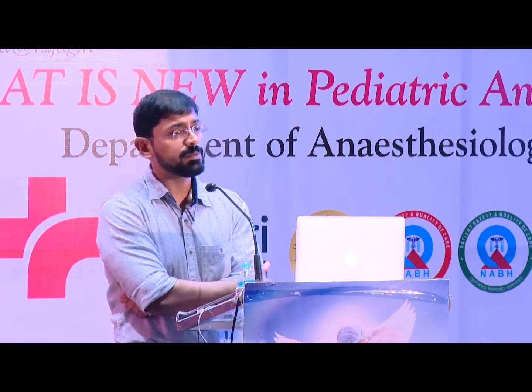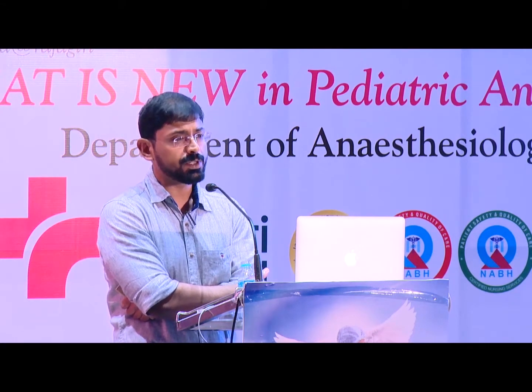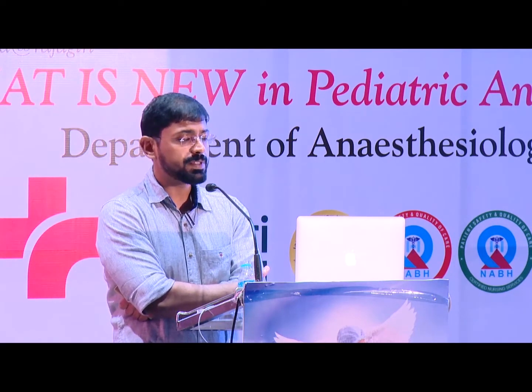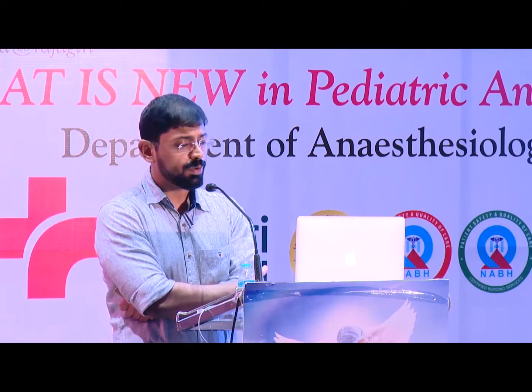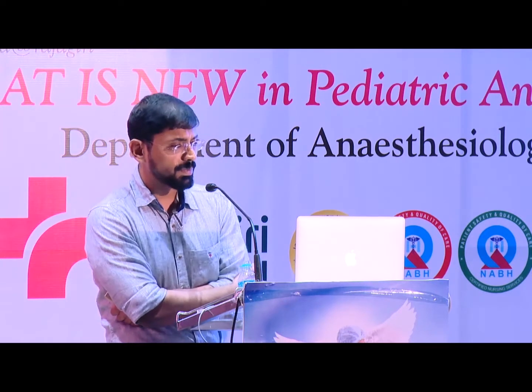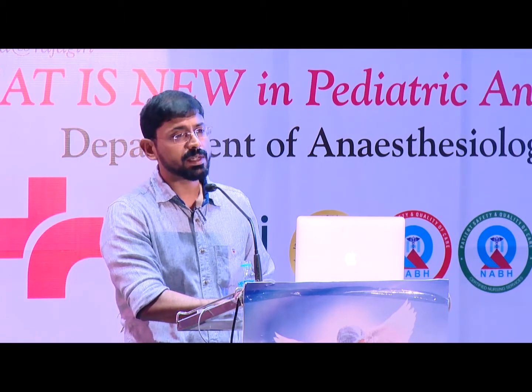Why is he on SIMV mode of ventilation? Again, because he's sedated and paralyzed, we are reasonably sure he's not going to start spontaneously breathing in a while. Why a PIP of 16 and a PEEP of 5? For reasonably normal lungs, we give only the bare minimum pressures, and the normal working range of PIP we can start with would be between 12 to 16, and for PEEP 5 to 6. So we can start with this and see how he goes.